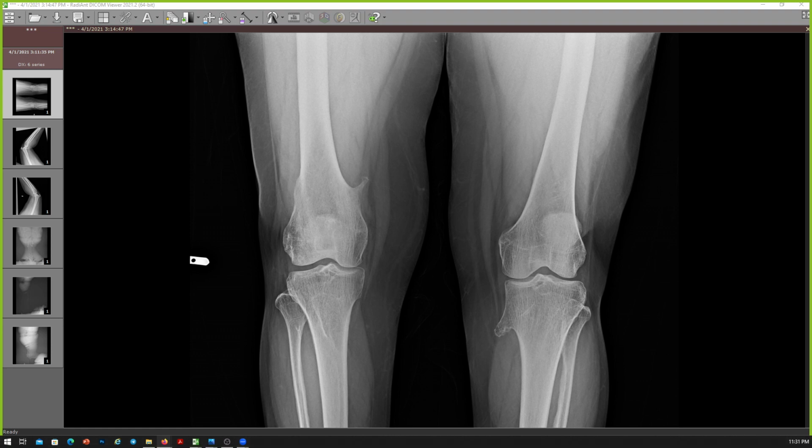Okay, what is the percentage of malignant transformation in this case? Because it's multiple, it's from 5 to 25%, and more than solitary. Other than the finding of a thickened cartilage cap on MRI, any other finding which would point towards malignant transformation? On MRI, yes: cartilage cap, new enhancement, an enlarging new soft tissue mass surrounding it, or any cortical breakthrough. This is on MRI. On scintigraphy, if there is any new uptake without fracture.